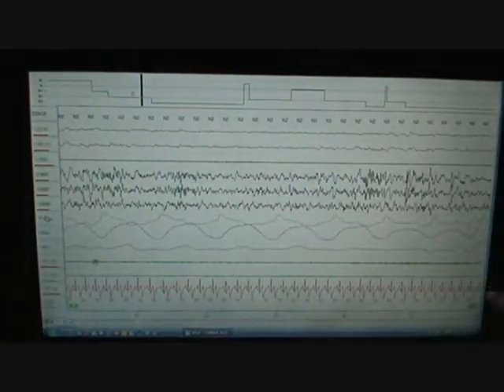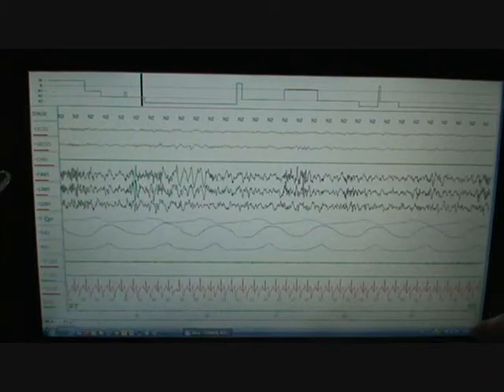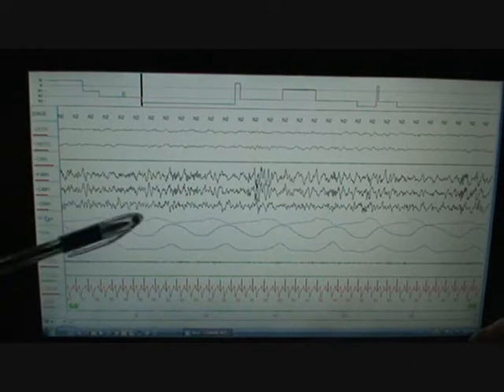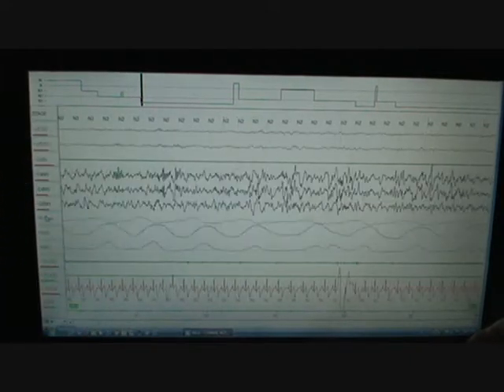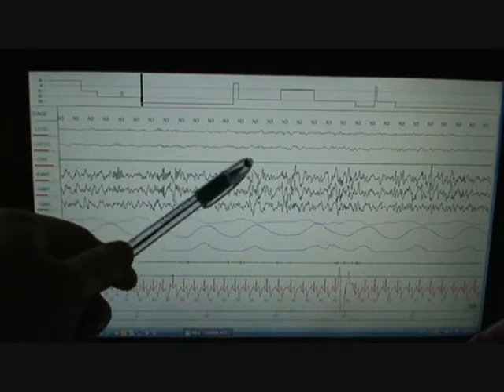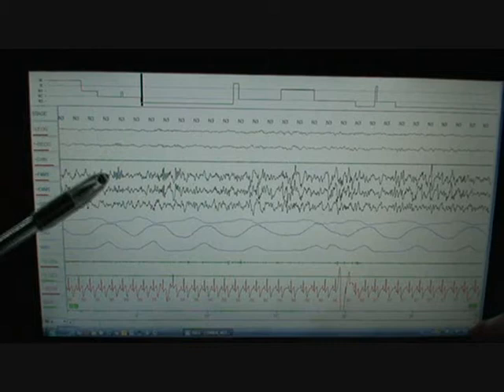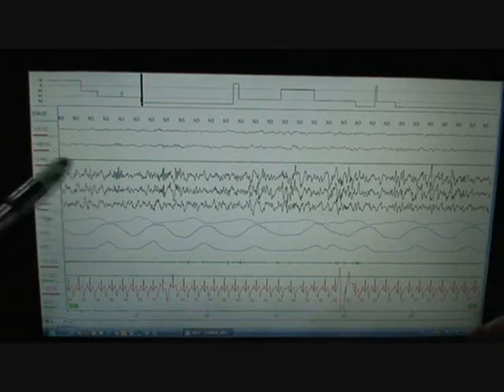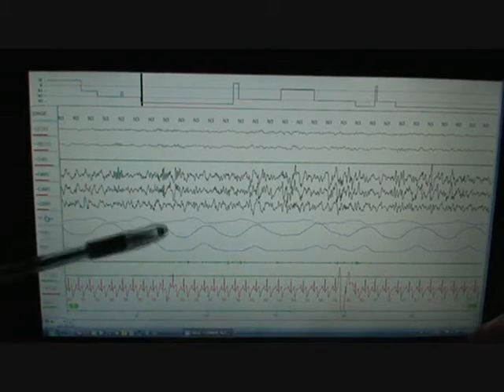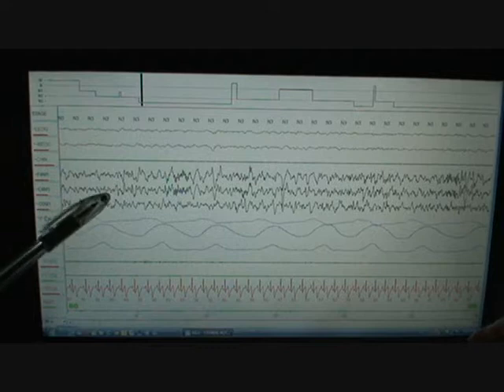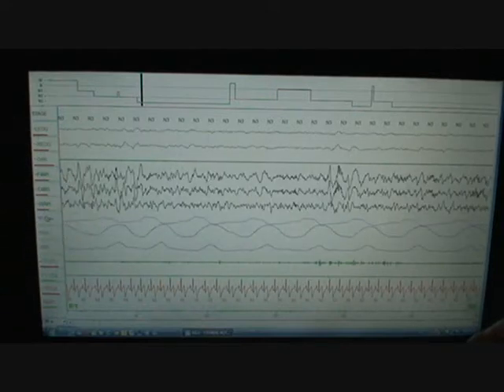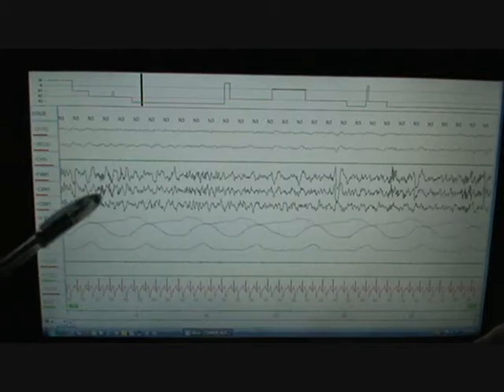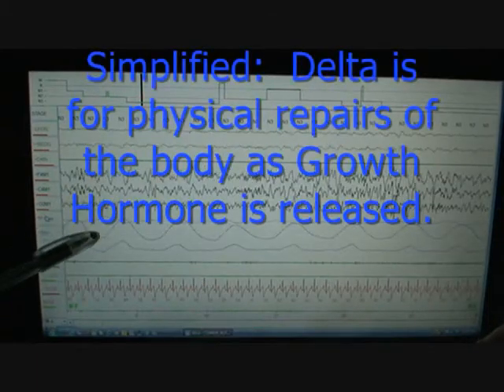So let's get to stage three. So stage three, this person being young, actually this should be stage three. I have it marked as two, but stage three is delta waves, which are 0.5 to two cycles per second. And they need to comprise at least 20% of the page. So that of a 30 second page would be six seconds. Then it needs to have a proper amplitude. So this is stage three. You can see nice, big, slow waves. This is when people are said to be their bodies are repairing themselves physically. That's the theory.